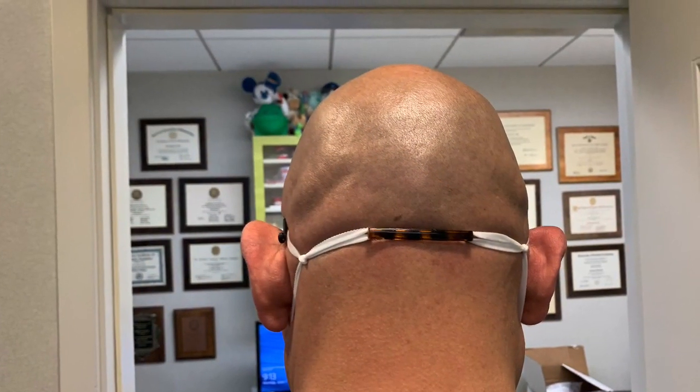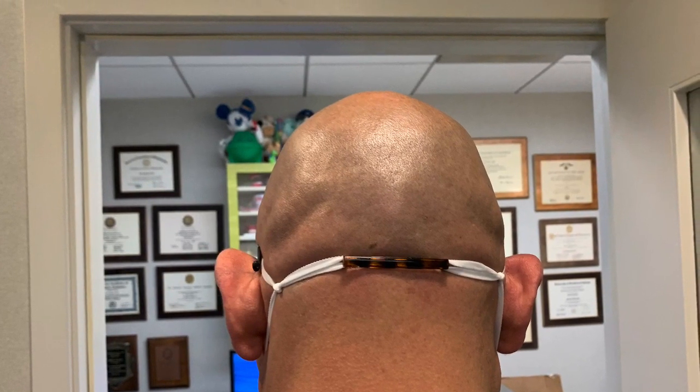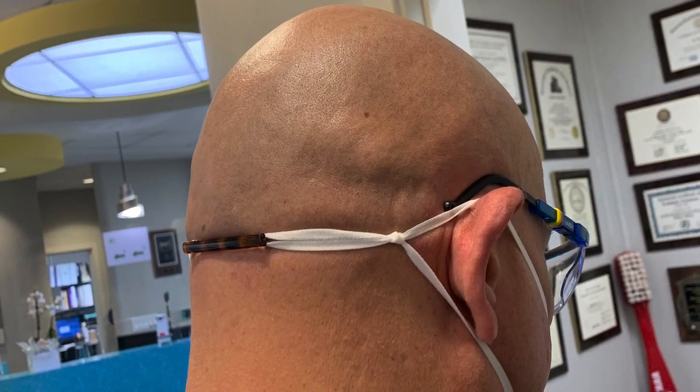Depending on the mask and depending on the person will determine whether they need to use both the barrette and the knots, or just the barrette only, or just the knots only. The nice thing is, this works with all ear loop masks.